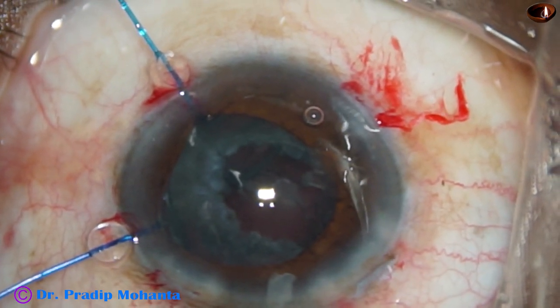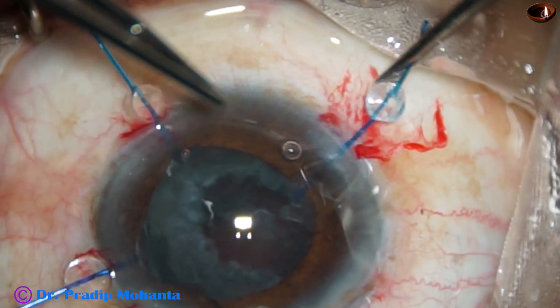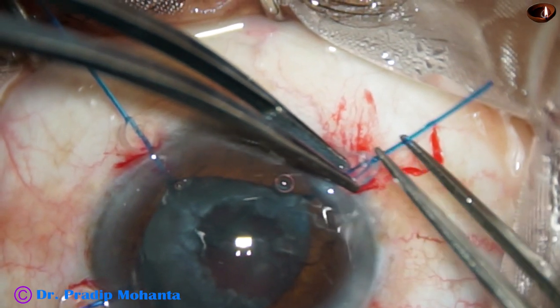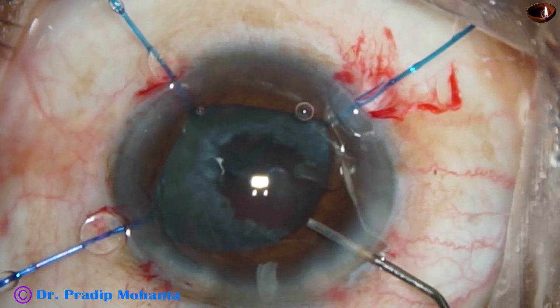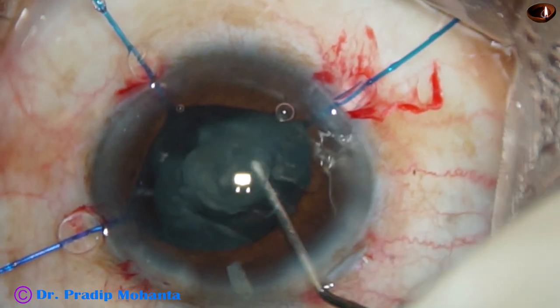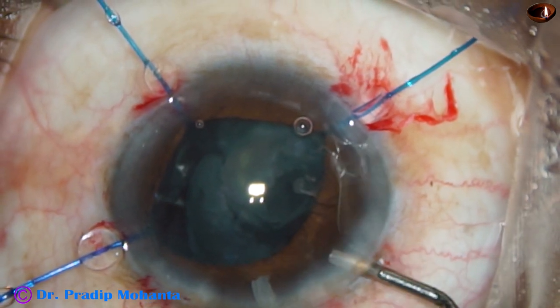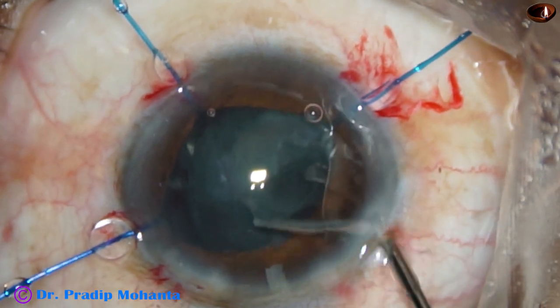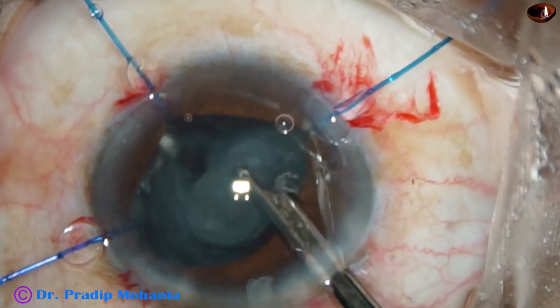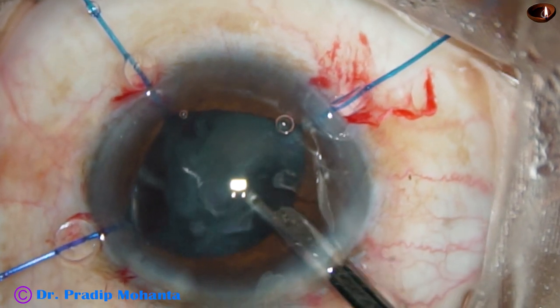I take another hook and use the side port at 8 o'clock, applying another hook to retract the iris there so that I can see clearly and my field of vision enlarges. As I do hydrodissection, the epinuclear shell gets dislodged. I inject viscoelastic, and as I try to aspirate with the Simcoe, some more vitreous strands come out.